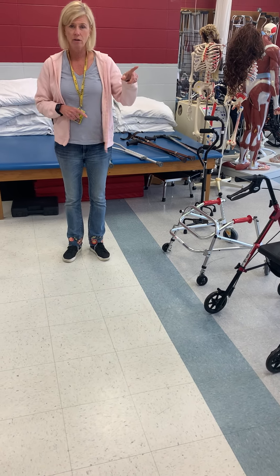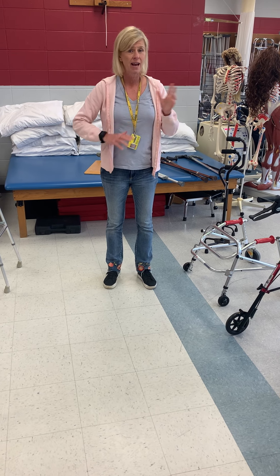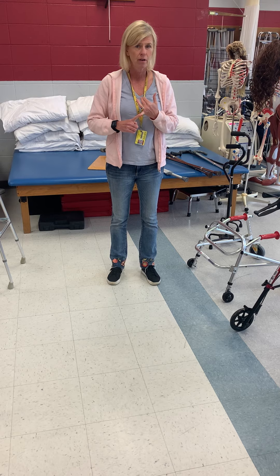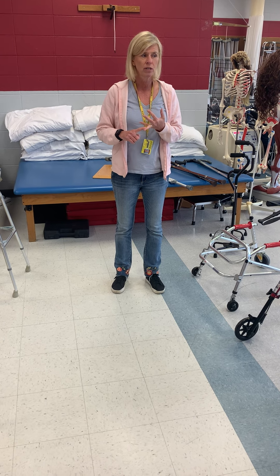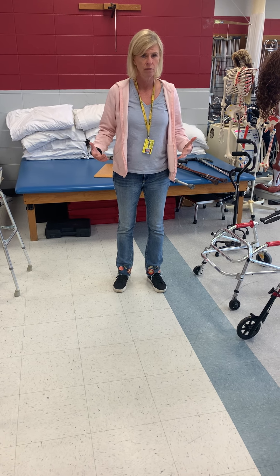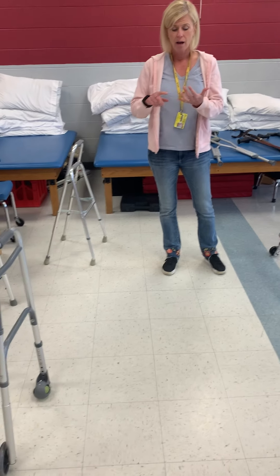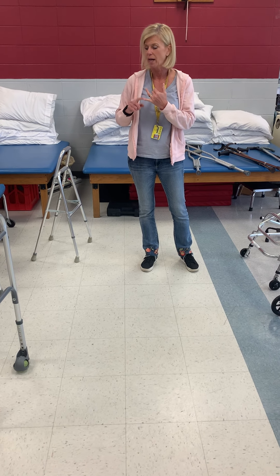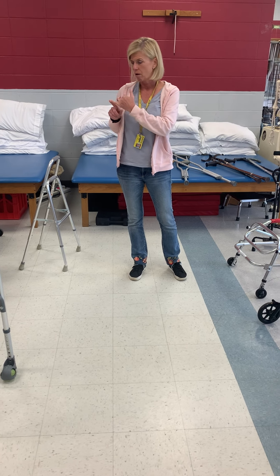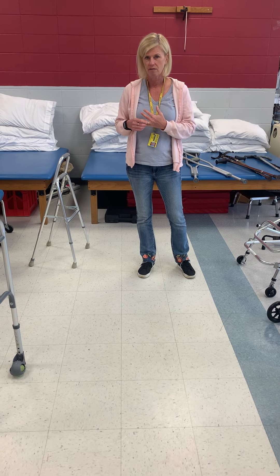Now we looked at the parallel bars earlier — with parallel bars, you don't have to advance anything and you need hardly any coordination. It's the most stable assistive device because nothing moves. From the parallel bars, the walker is more stable because it's only one item to move, so you can have less coordination and it's still a pretty stable assistive device.